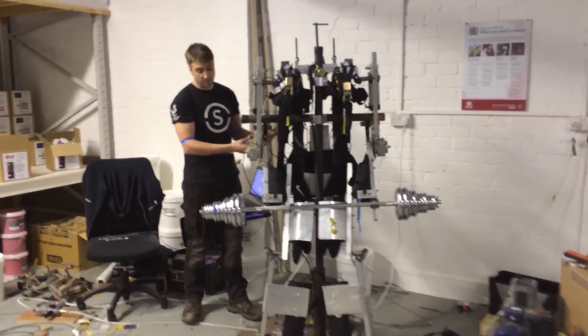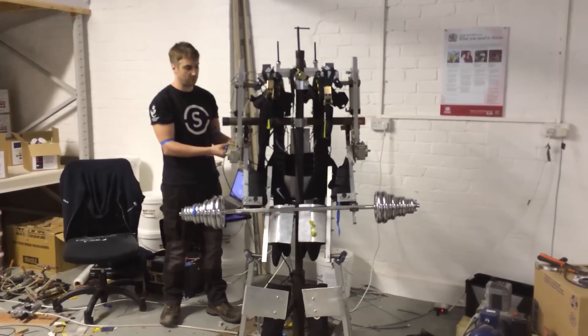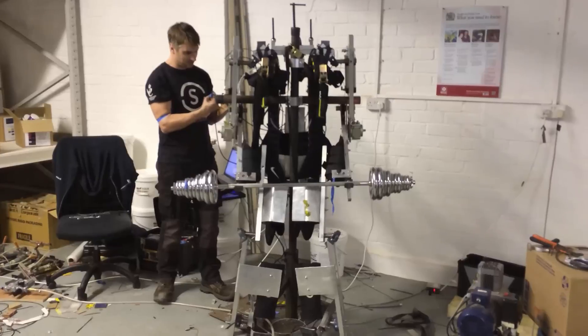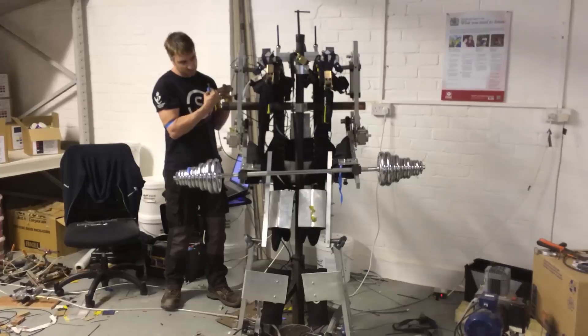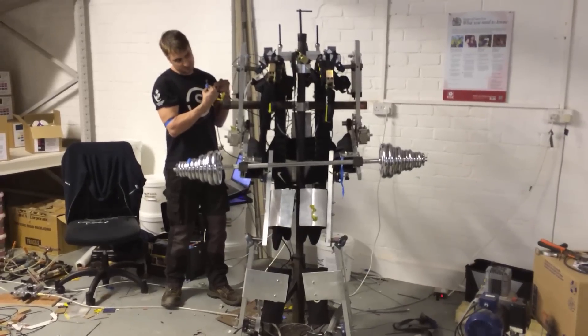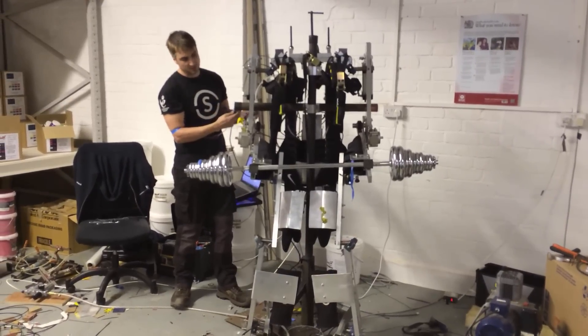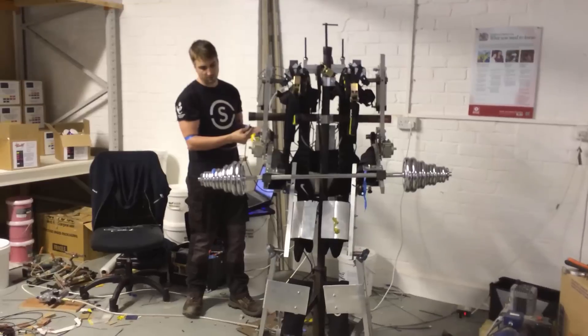We're now going to show independent control when I'm not in the suit, just to see if it'll lift happily by itself. This is a bit shaky because it's off my muscles and I've got nothing to strain against. But as we can see, it'll quite happily hold it until I dump it down, where it's going to go down quite fast.